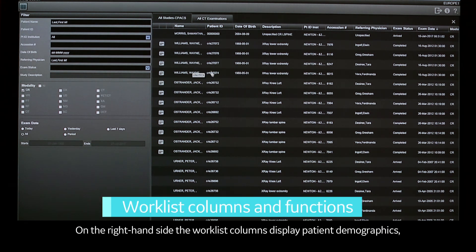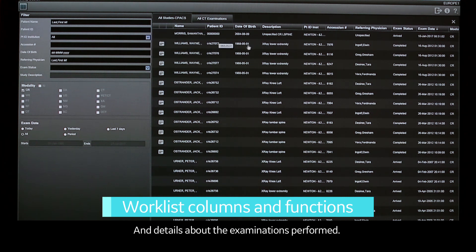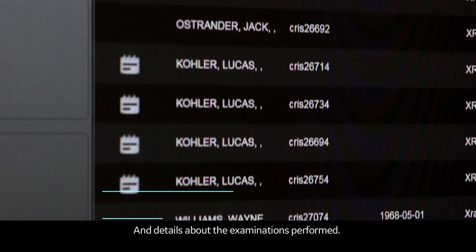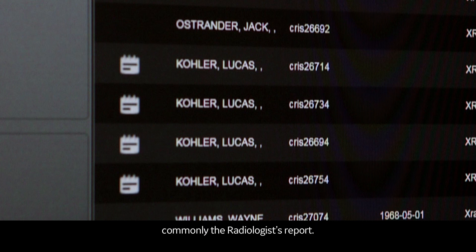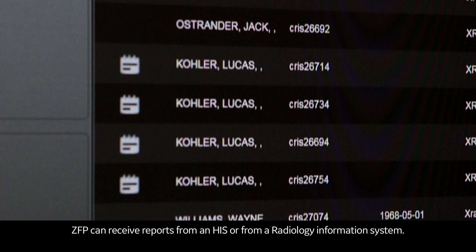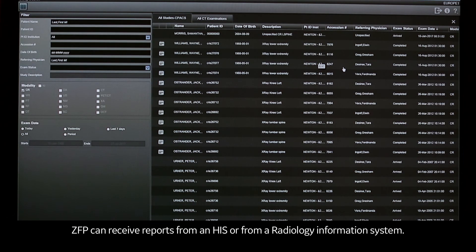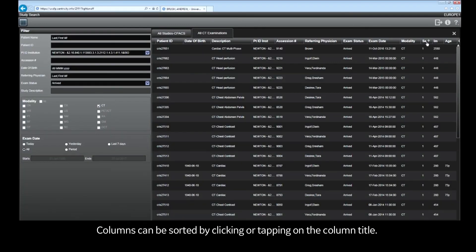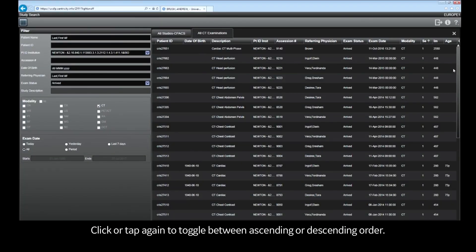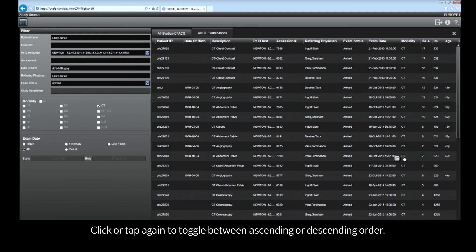On the right-hand side, the work list columns display patient demographics and details about the examinations performed. The report icon shows that a report is available for this exam, commonly the radiologist report. ZFP can receive reports from an HIS or from a radiology information system. Columns can be sorted by clicking or tapping on the column title; click or tap again to toggle between ascending or descending order.